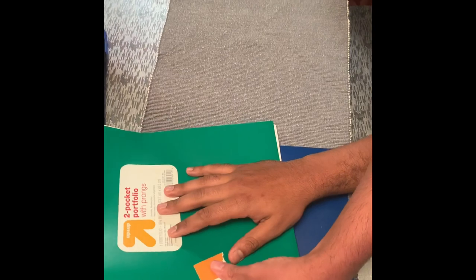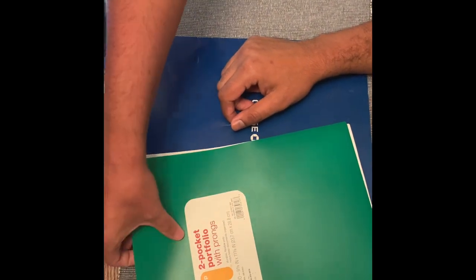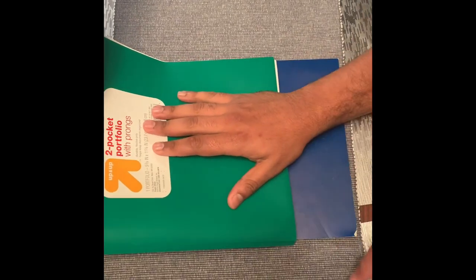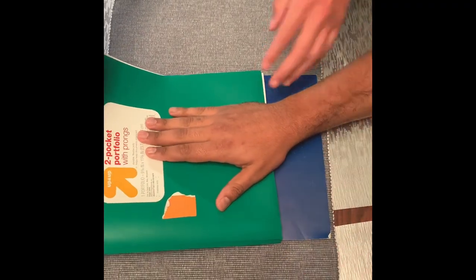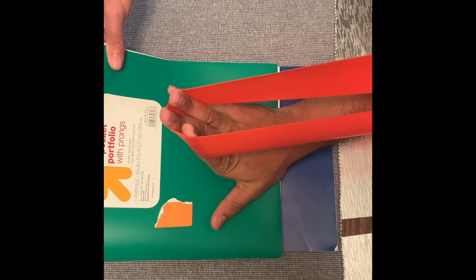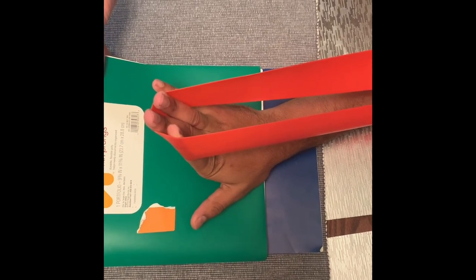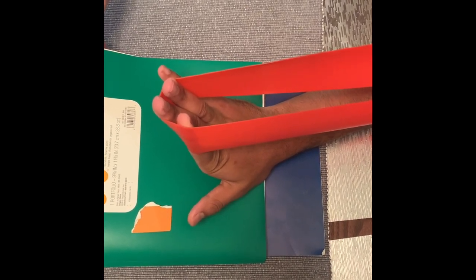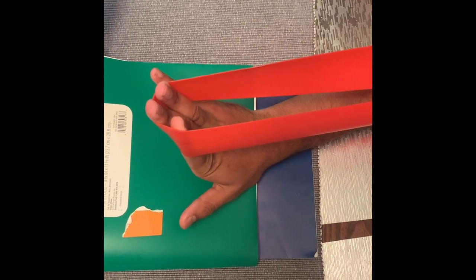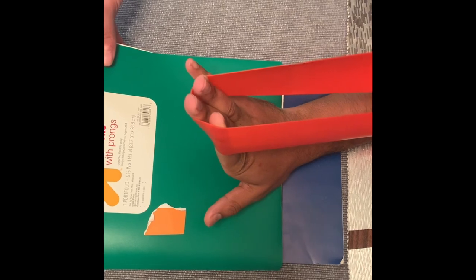The last view is going to be the wrist carpal tunnel. We're going to need a device that places the hand at 20 degrees. I'm going to place the marker, and the patient will use this band. Can you put this band on these three fingers and pull back? The central ray is going to be directed 25 to 30 degrees cephalic, entering approximately one inch distal to the base of the fourth metacarpal. The anatomy demonstrated is going to be a tangential projection of the carpal canal, including the palmar aspect of the greater multangular, the tuberosity of the navicular, the lesser multangular, the capitate, the hamular process of the hamate, the triquetrum, and the entire pisiform.